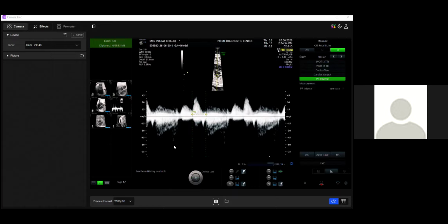So it's variable, varies with the heart rate. Previous measurement was 106, 104, and then it's 116, 113. Less than 130, we don't need to worry. We scan a little more frequently. If it has been 130 to 150, 160 and 170 above, we get worried. So we have a good range. All right.